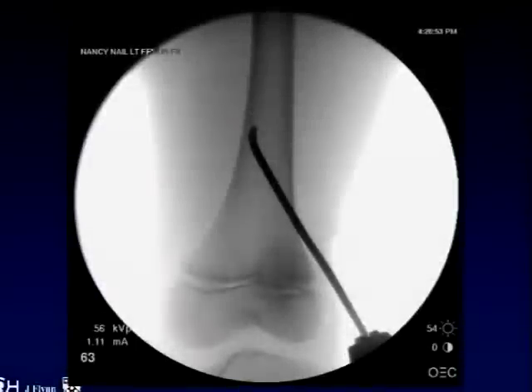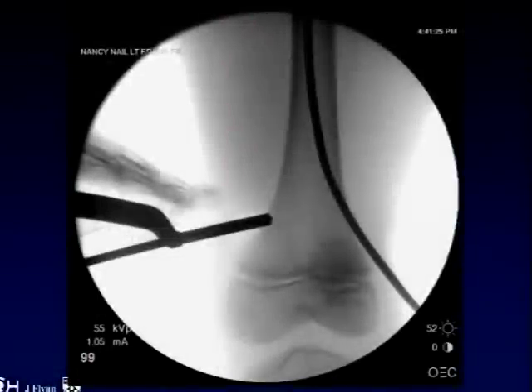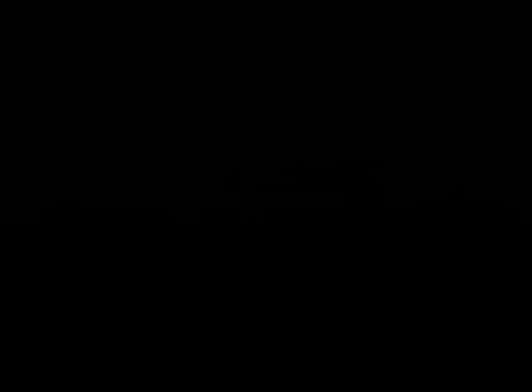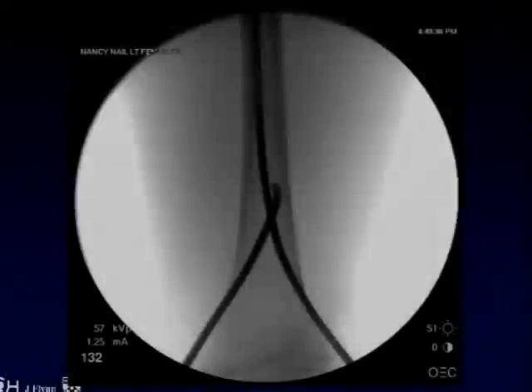These next images show the nail turning the corner, abutting against the cortex, and then eventually advancing up the canal. You'll definitely reach a point where you feel some resistance as the nail abuts up against the cortex. These next pictures show us starting the other nail — dropping our hand down, drilling a very oblique drill hole, and passing the second nail up into position.